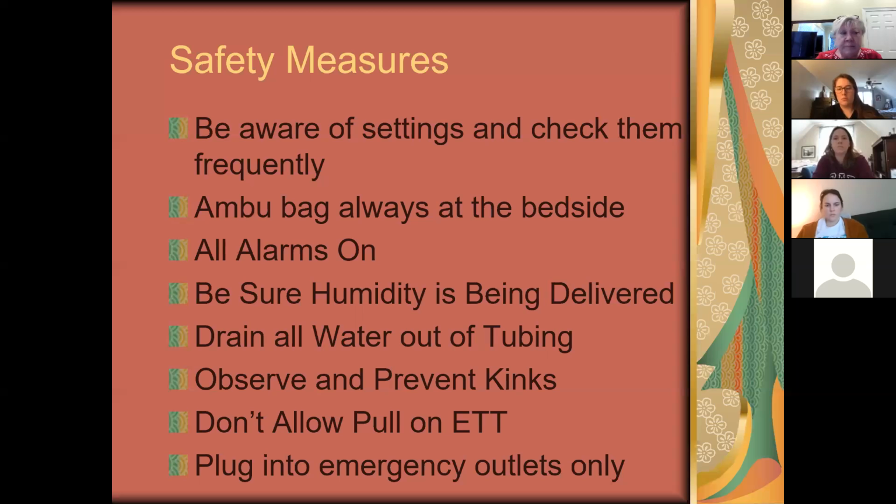Ambu bag always at the bedside, and the mask always taped somewhere or at the bedside also. You keep your alarms on. If your alarms are alarming, then call respiratory and find out why they are alarming.